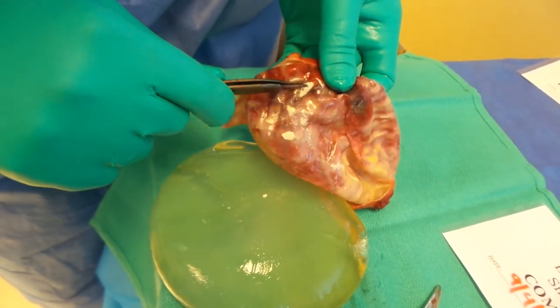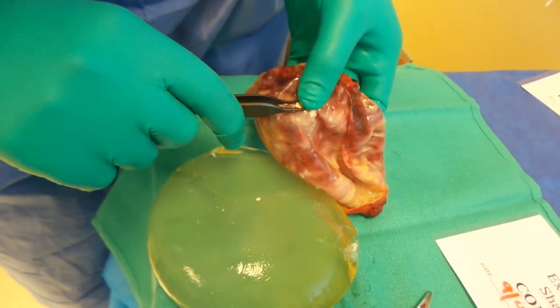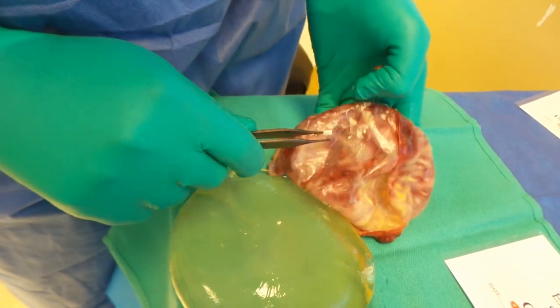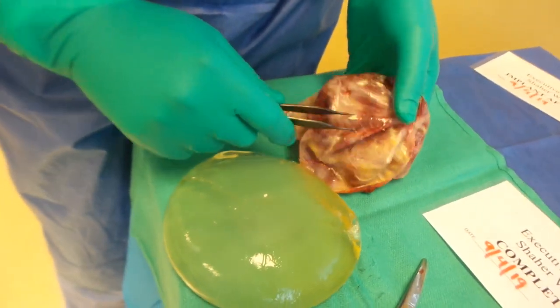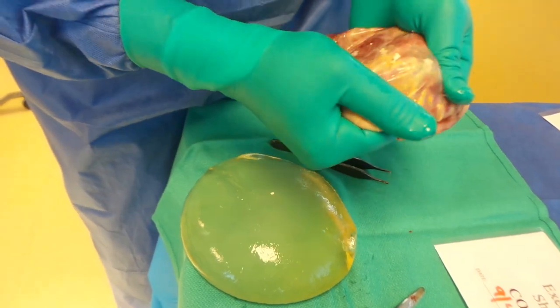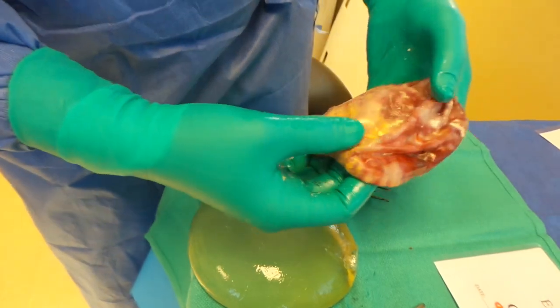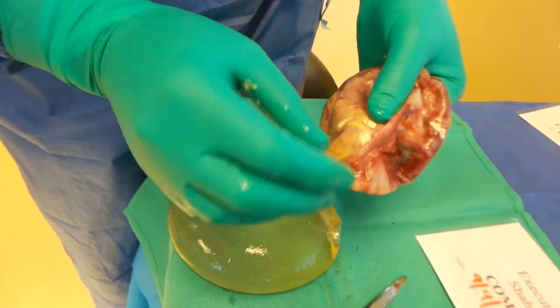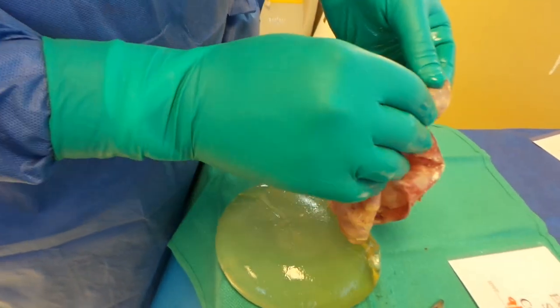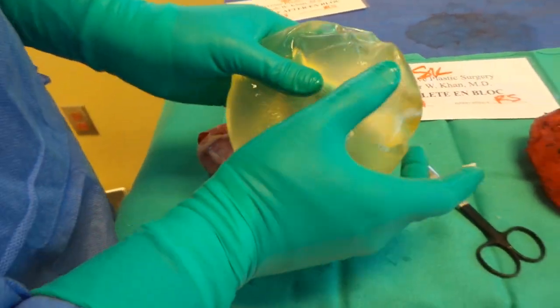It's like sandpaper concrete. I'm going to try to snap this in half. You can see this is like crystallized sugar at the bottom of a cup — all of this is abnormal. No matter how hard I try, there is abnormal thick calcification slash silica, very abnormal inconsistency. You can see this is an implant that's been ruptured, and we will see where it has ruptured from.